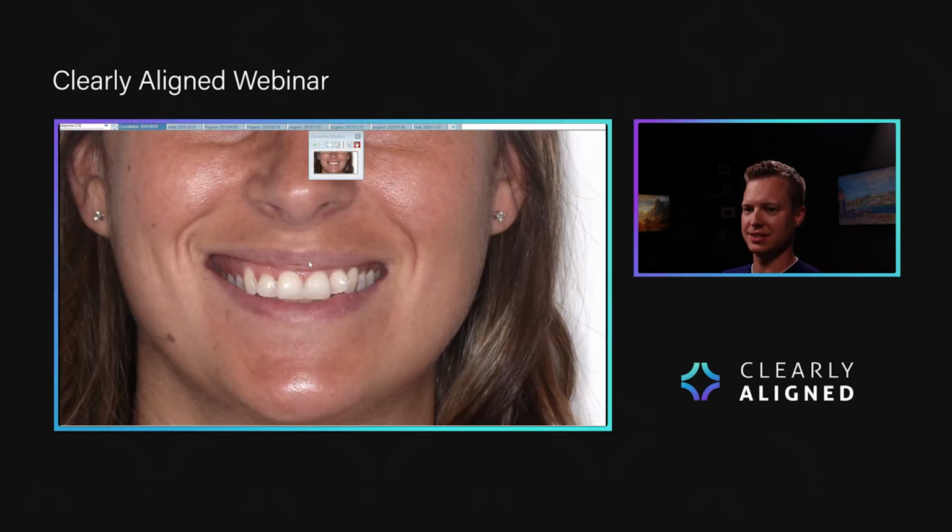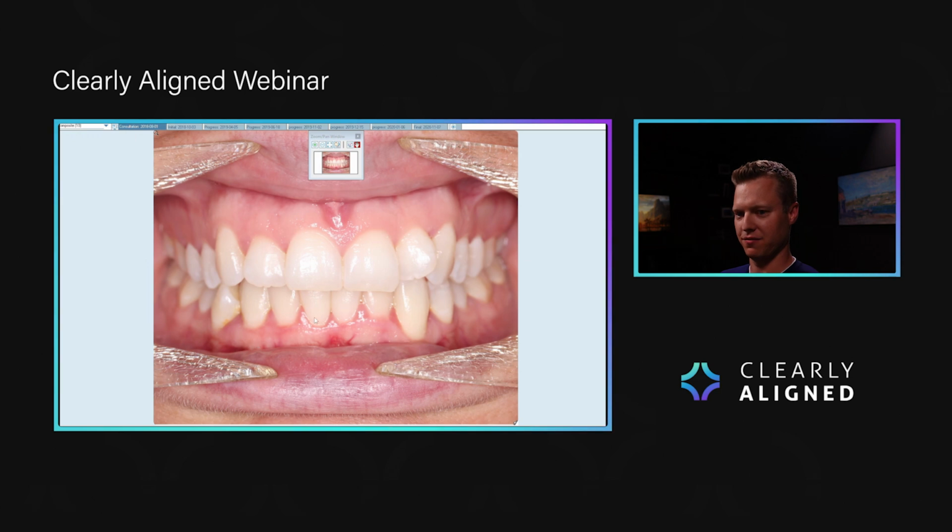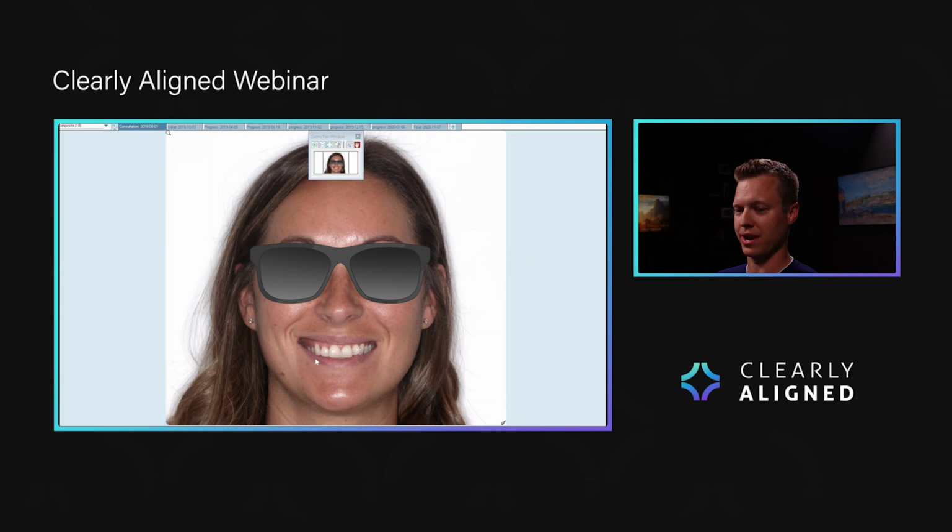But the thing that she doesn't like, or that she doesn't really, I guess, fully understand or know, is the fact that she's got a cant. So when we look at her smile, her quad 2, her upper left, sits higher. Look at the canine positions. So it sits higher than her upper right. These teeth have all super erupted. And likewise then, if you look at it from the front view, the lower right premolars and molars also sit lower than the upper teeth. So essentially the upper maxillary right segment and the lower right mandibular segment all sit more inferior, right? Everything's come down. It's not just the upper teeth that need to move, it's also going to be lower teeth.